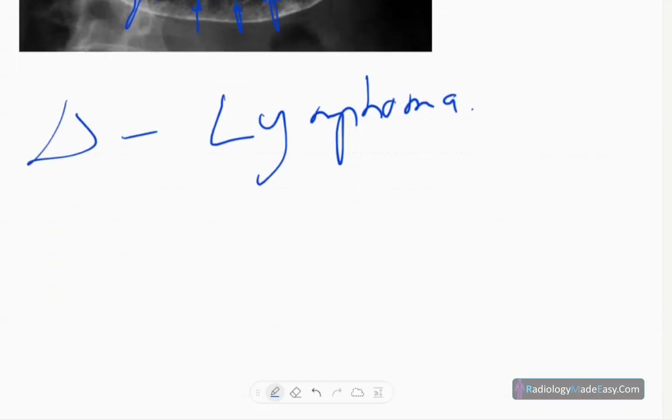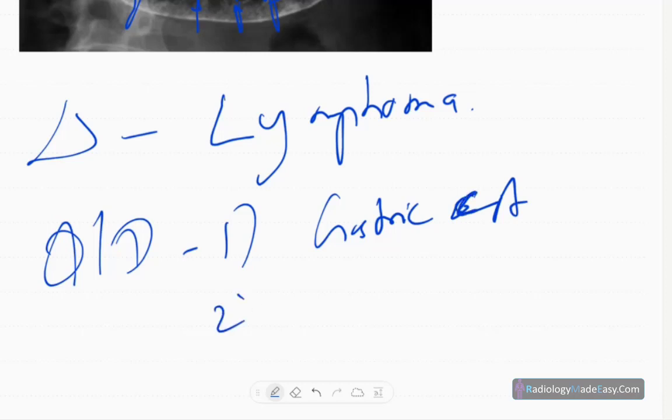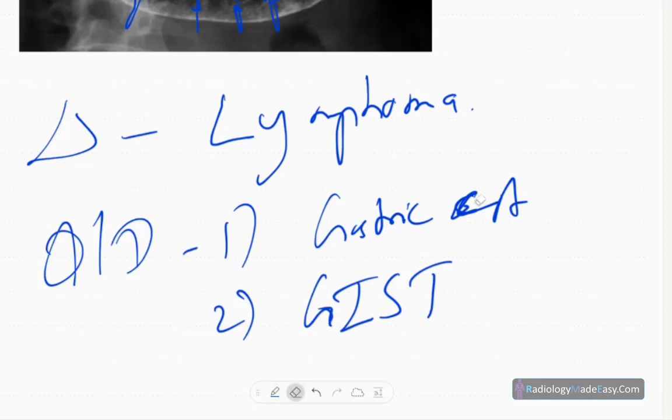The differential diagnoses are gastric adenocarcinoma or gastric CA, and also GIST, gastrointestinal stromal tumors.